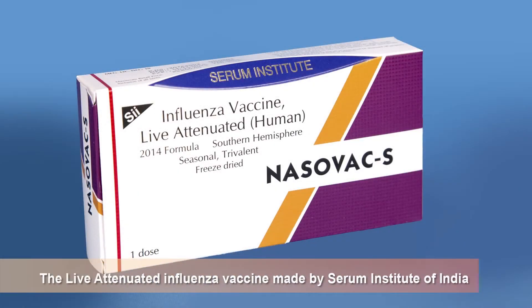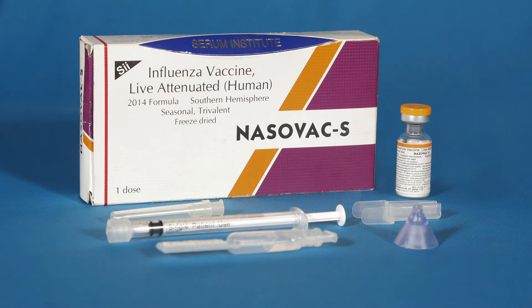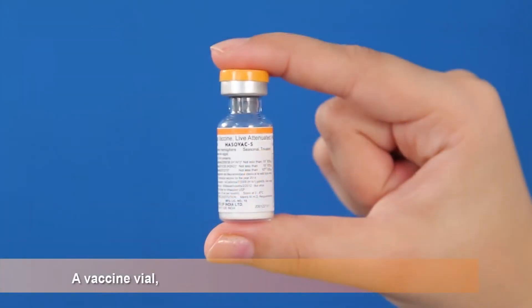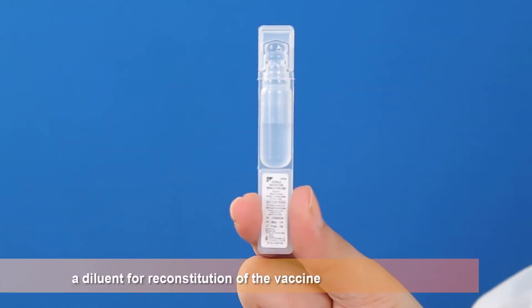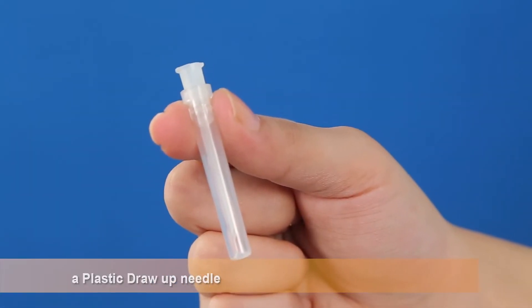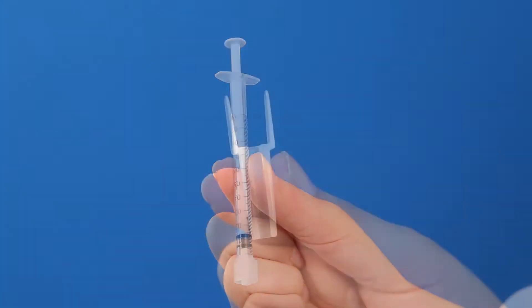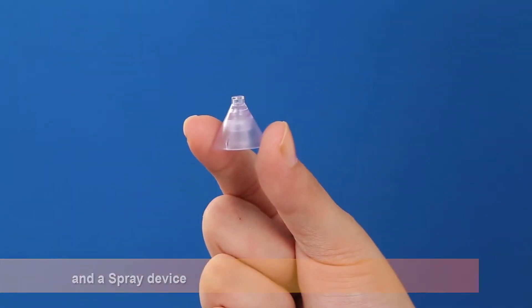The live attenuated influenza vaccine made by Serum Institute of India is an intranasally administered vaccine. This pack contains a vaccine vial, a diluent for reconstitution of the vaccine, a plastic draw-up needle, a 1 ml reuse prevention syringe, a dose divider and a spray device.